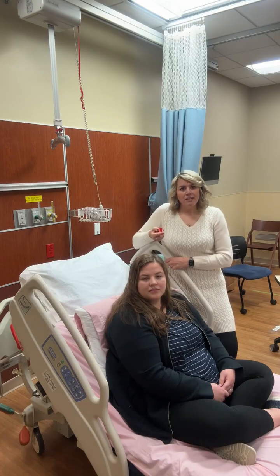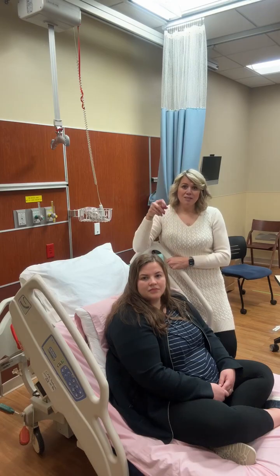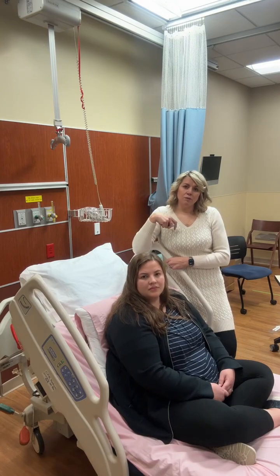Those side effects we need to know about before they give them another dose. So they wait a minute, they feel okay, and now they can do it again. And now that second dose is going to get even deeper because the first dose already started it. So that's why there's got to be a 1 minute hold.